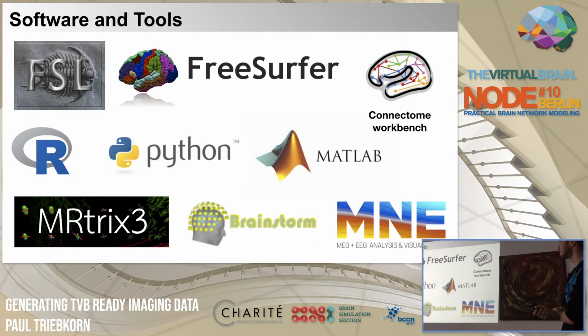Connectome Workbench is a tool from the people inside the Human Connectome Project, especially to work with the CIFTI file format. This is very helpful. Of course, some tools here, especially machine learning, rely on programming languages and sub-packages within them, such as Python and MATLAB. The tools up here are then mainly called or organized using shell scripts, so something like bash comes in handy when you're working with these. A little bit of knowledge of Python or MATLAB will be handy as well.